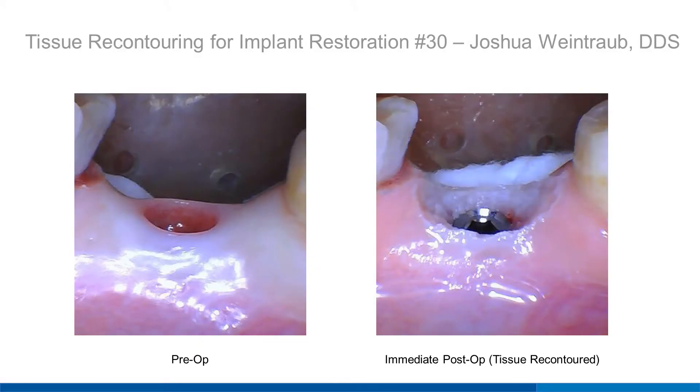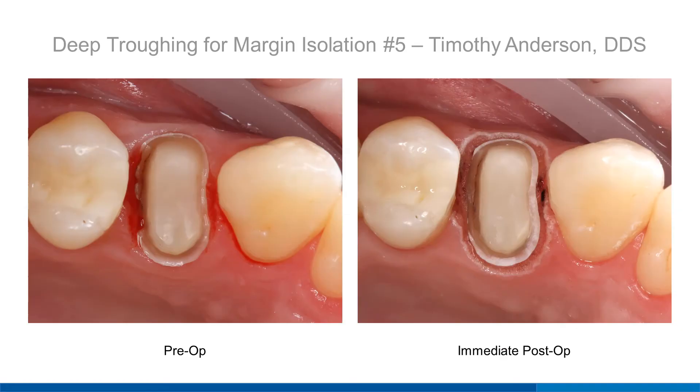This case demonstrates Solea's ability to quickly recontour significant gingiva without an injectable anesthetic or bleeding. Due to the clear surgical site enabled by Solea, it was possible to proceed with definitive restoration immediately following recontouring. Solea was used to precisely and easily trough around the crown prep for imaging in a clean, bloodless field, followed by the immediate placement of the crown. No retraction cord was needed. This took less than 15 seconds.